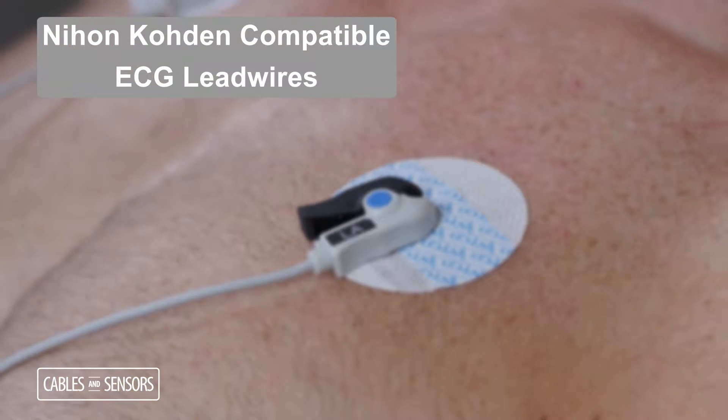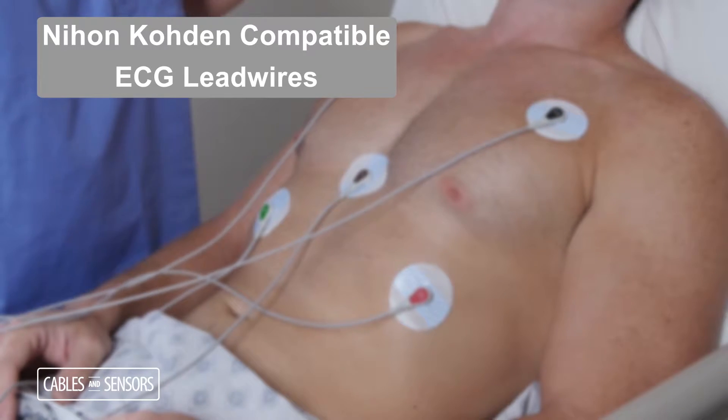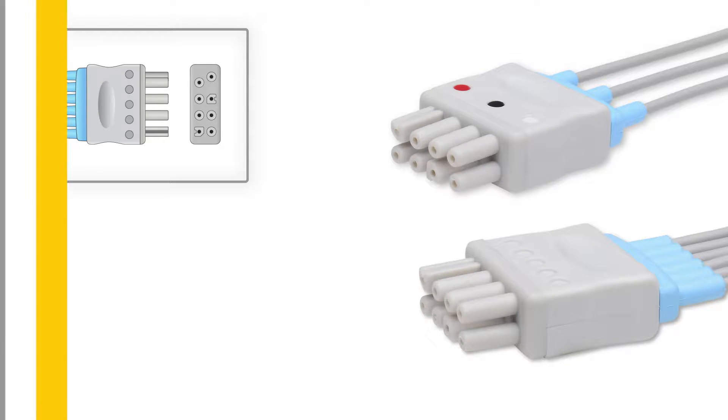ECG lead wires. Cables and Sensors manufactures high quality ECG lead wires, guaranteed to perform equally to the original manufacturer. This cable is 36 inches long and is available with the following lead wire endings.